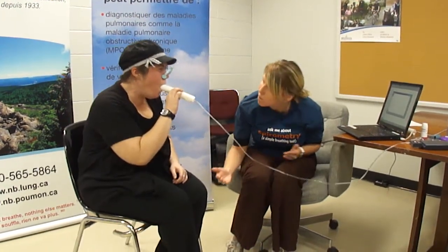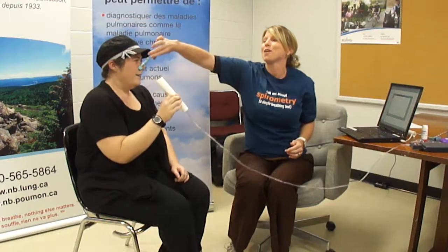Four, three, two, one. Big breath back in. Take it out of your mouth. Excellent. Yay. Great.